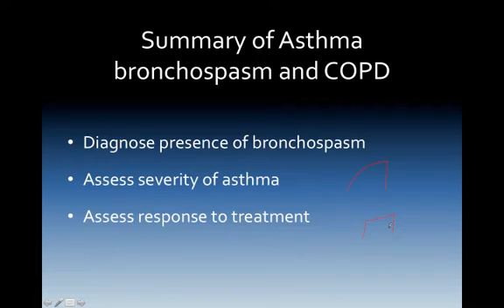Now, what we should see in asthmatic treatment is that at first we may have very small, tiny shark fins, low amounts of CO2, and that's because they're under bronchospasm. They're still trapping air. We cannot see the full gas sample, but once we start opening them up, we will see an increased rise in gas sample, and that is until we correct the respiratory acidosis that they're currently in.